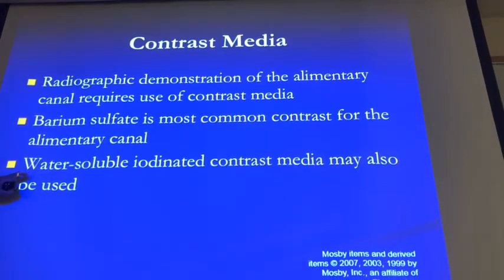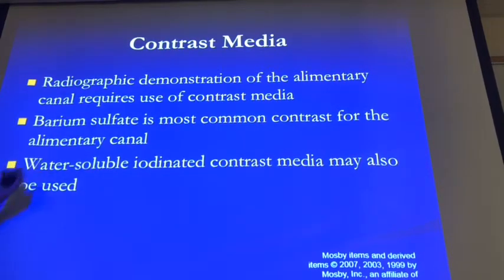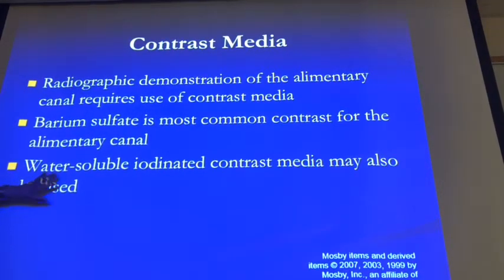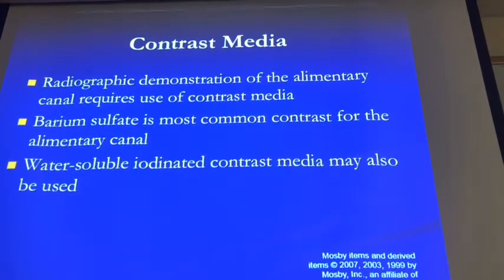Now, how come we don't just use iodine before every exam? Because it is water soluble, it gets absorbed, and if you wait too long, you're not going to see it in your intestines. In addition, because it's incorporated into your circulatory system, patients can have a reaction to it. That's not the case with barium, because barium is just going through a tube inside our bodies. It's never absorbed into the circulatory system. See the difference?